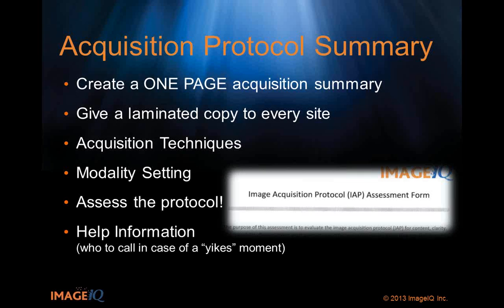They'll see them maybe 6 months apart. So they're not going to remember that you had a specific acquisition protocol in Appendix B in this big document. That's why we said at the beginning that the definition of an imaging protocol really is a set of documents. A lot of this you could see as sections in a document. It's probably good to be a separate document that can be put somewhere and pulled out, laminated, put in a binder at the modality.